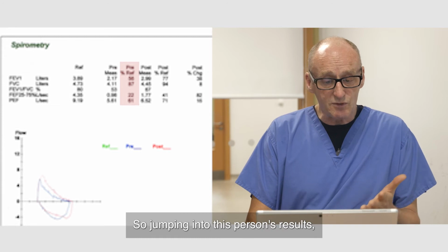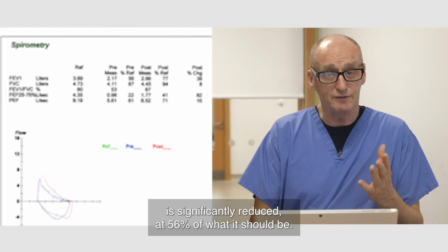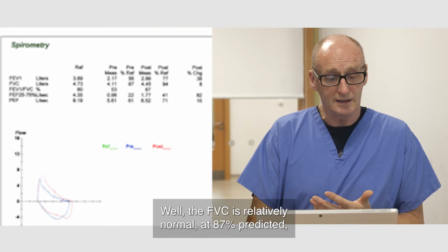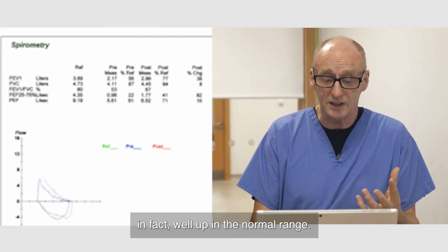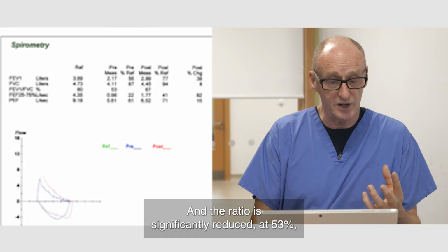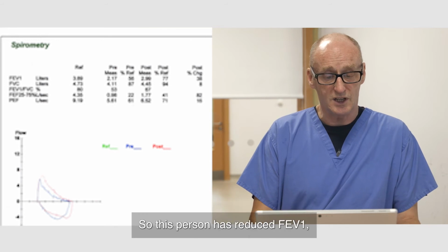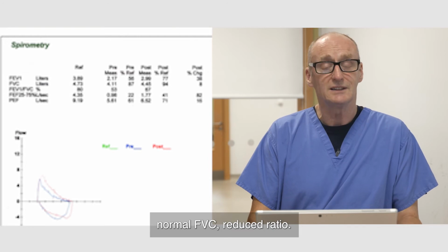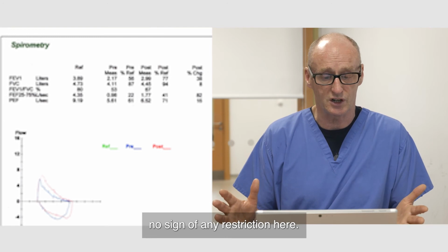And the third column is what percentage of the predicted value did the person do for each of those parameters. So jumping into this person's results, you can see that the FEV1 is significantly reduced at 56% of what it should be. So what's the cause of that? Well, the FVC is relatively normal at 87% predicted, in fact well up in the normal range. And the ratio is significantly reduced at 53%, the absolute ratio 53%. That should always be above 70. So this person has reduced FEV1, normal FVC, reduced ratio, that is moderately severe airflow obstruction. Definitely airflow obstruction, no sign of any restriction here.